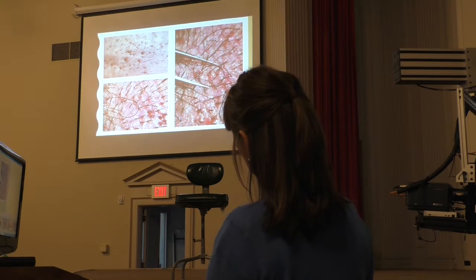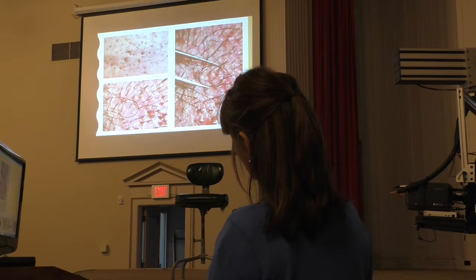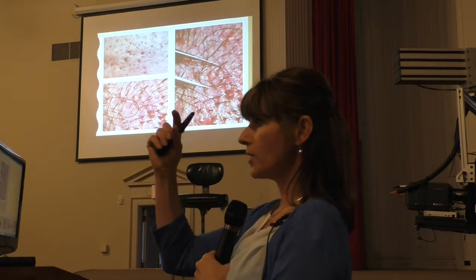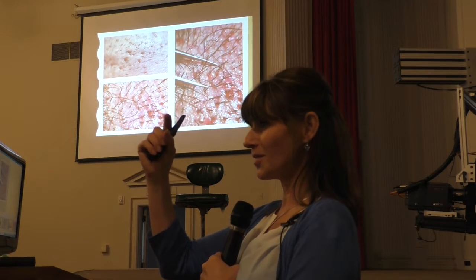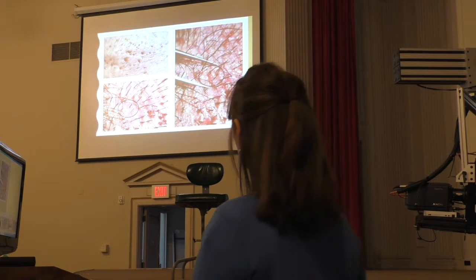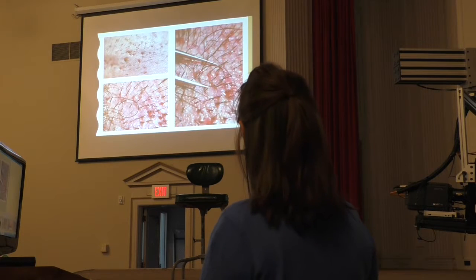When we harvest donor, we leave hairs a certain length. So for example, all these grafts are the same length and they're placed at the surface correctly. These 2 are lower, so how much hair is sticking out of the skin is the first indication that the graft is placed underneath. So what needs to happen is they all have to be pulled up.